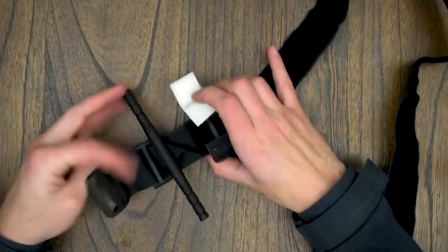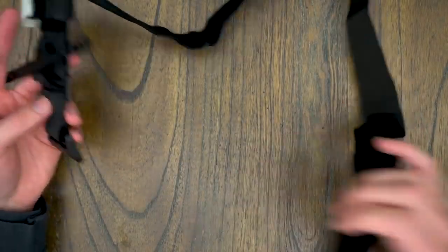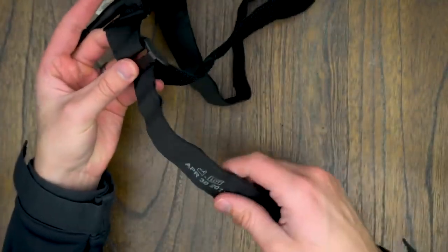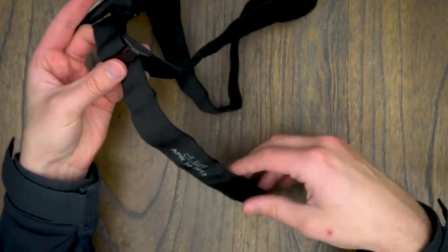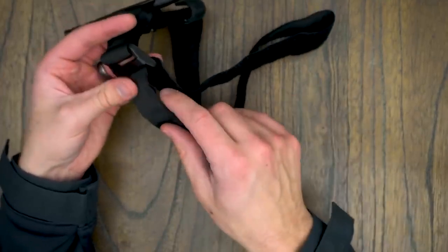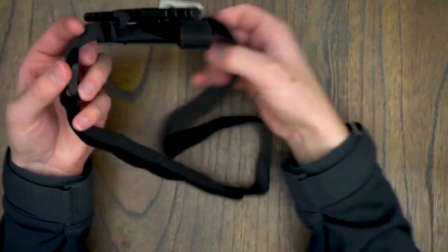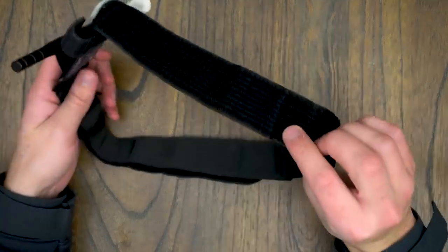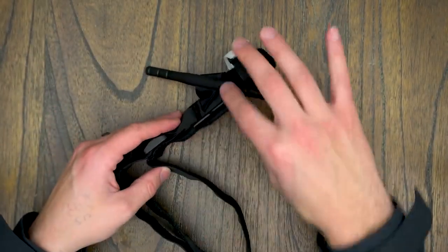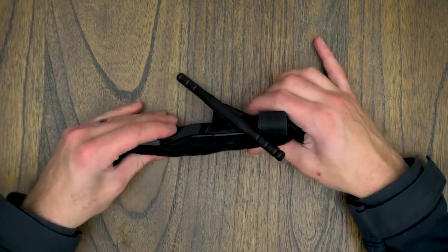To fold this method, if you take the tourniquet and you've completely taken out the strap and everything, all you have to do is you feed the red tip through the first buckle, and you might have to play around with how big you make this initial loop, but you just play with it and figure out what works for you and what size it needs to be. So you pull it through the loop to a point, and then you fold it back on itself. As you do that and you have this loop here, I'm going to take this end and fold this under the tourniquet about the length of this plastic portion to the buckle, and I'm going to fold this portion back on itself.